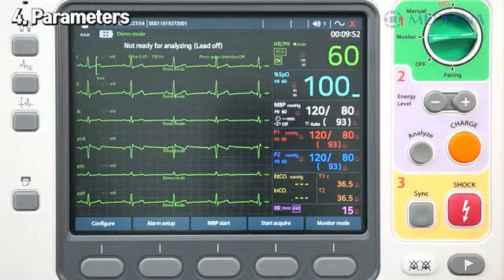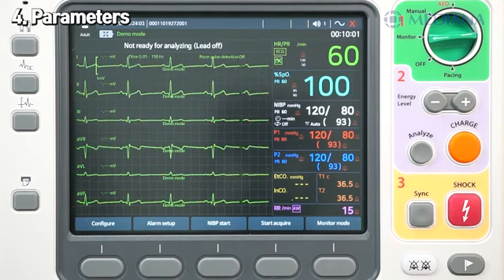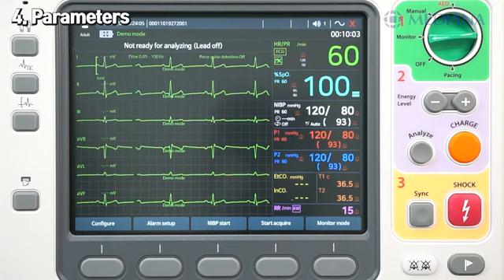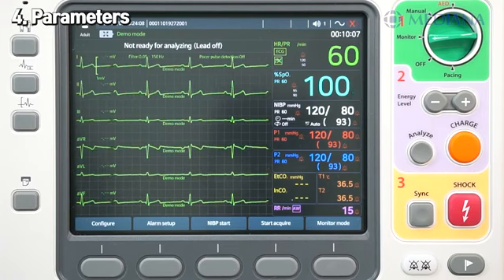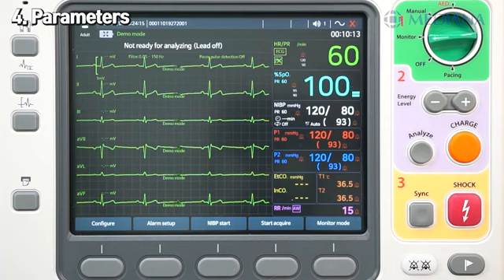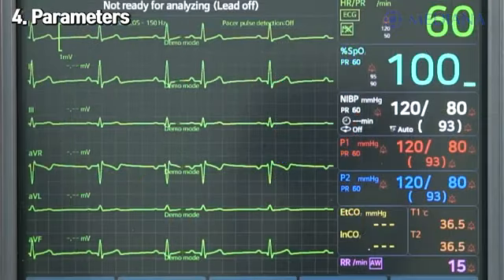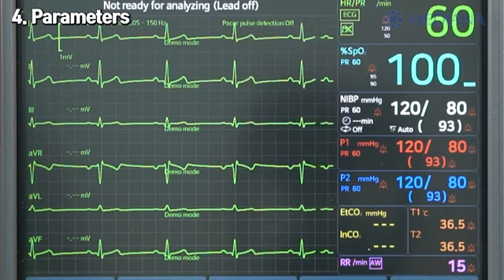A brief explanation regarding the algorithm we use for ECG is that it's considered to be best in class by cardiologists. Developed by the University of Glasgow in the UK, it includes signal processing, diagnostic interpretation of electrocardiograms from individuals of all ages, and analysis of cardiac rhythm. It also has leading clinical advantages and proven performance for STEMI analysis.